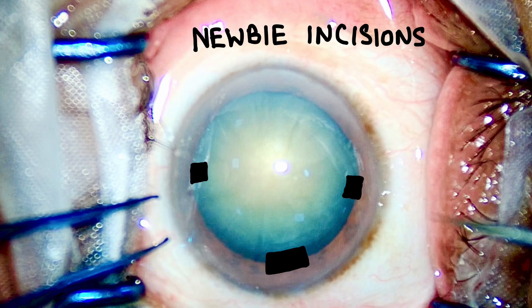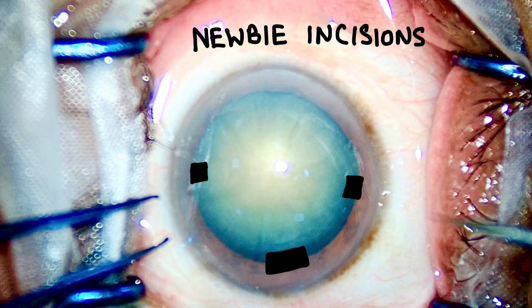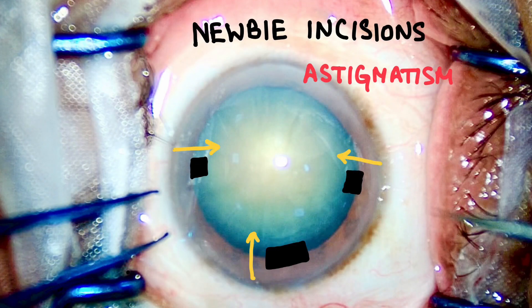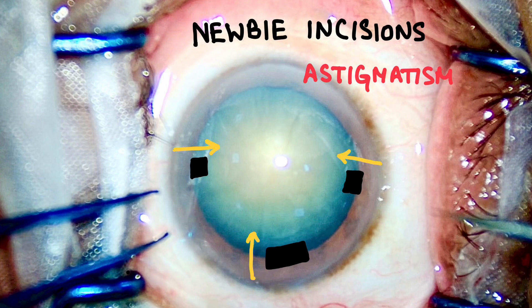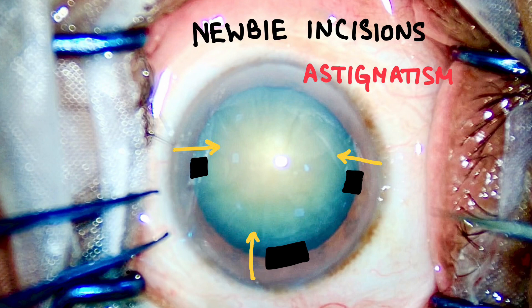The third case: what a newbie does is create side ports that are too central in location, going inside toward the center of the clear cornea. The side effect of these ports is they cause a lot of astigmatism — these incisions are not limbal in their location. The newbie has created side ports and main ports toward the center of the cornea, which causes a lot of astigmatism. The patient will never achieve 6x6 unaided vision post-operatively, will need cylindrical correction, and will question the doctor: 'Why did I not get 6x6 even after a perfect cataract surgery?'